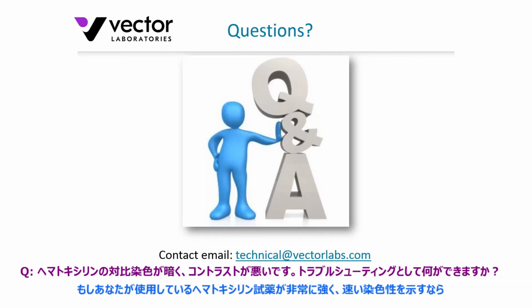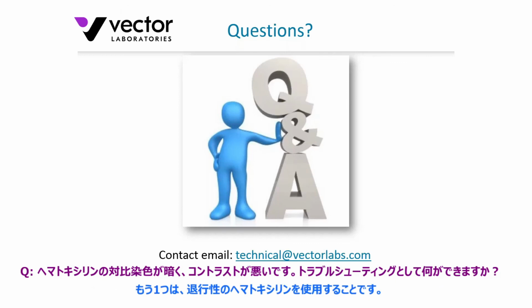Type 3 is like a triple strength hematoxylin. So certainly the concentration of hematoxylin there, if you are using, say, a Gill's, very strong, very quick uptake of the stain. You may want to look at a different formulation of hematoxylin, such as a Gill's 1 or indeed another type of hematoxylin that would help you. Another opportunity would be possibly using a regressive type hematoxylin, whereby you can control the intensity by applying that differentiator and dialing back the intensity, almost like washing it off until you get the desired intensity.